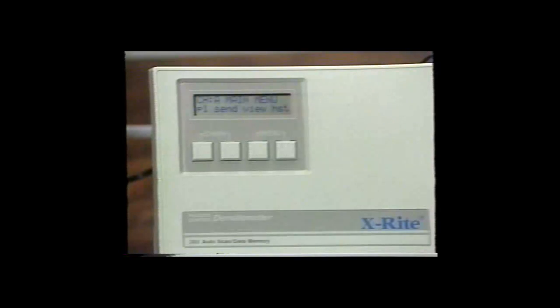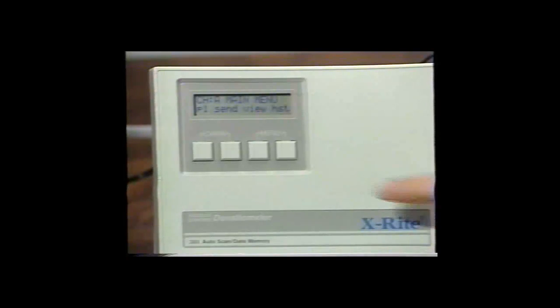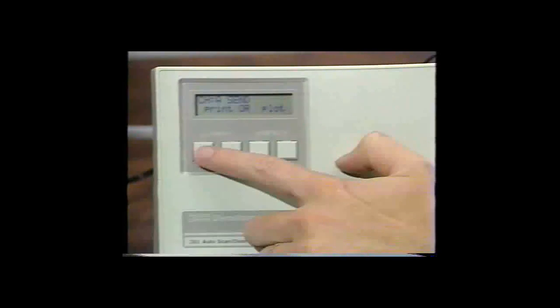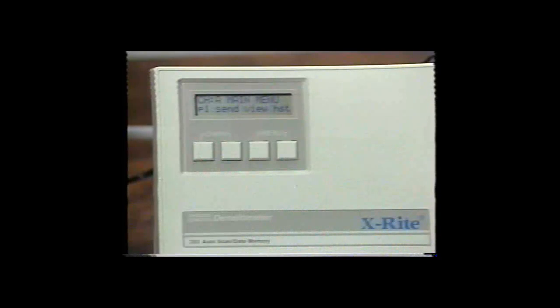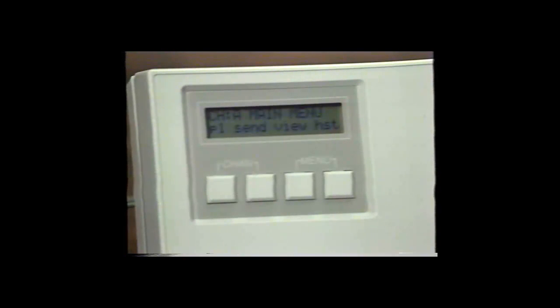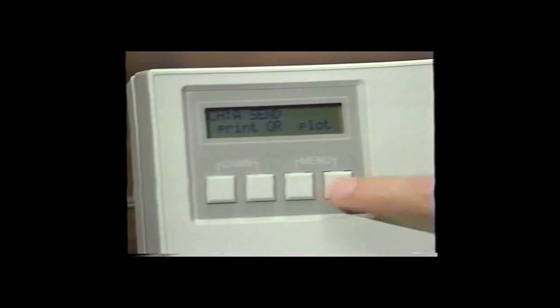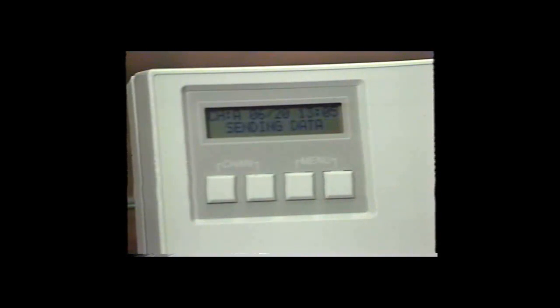Once the printer has been properly connected to the densitometer, you can begin generating reports. To generate the simple format print of the 21-density steps, at the main menu simply hit the Send key, then select the print function. The densitometer will immediately send the data to the printer. The second report format is accessed the same way: press the Send key and push the plot function. The data is sent to the inkjet printer and includes all processing control parameters from the last strip read, as well as an H&D curve.